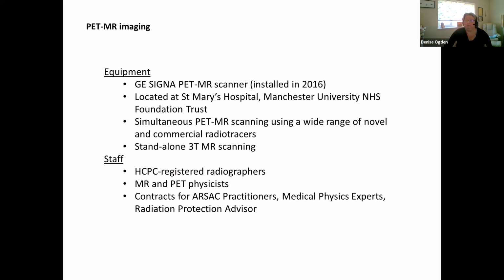So you'll have heard of PET-CT scanning, and also MR scanning, as standalone methods of imaging. This actually combines PET with MR, so there's no CT involved there. And for those, we inject participants with radio tracers. So that's when you can see where the radio tracer ends up.